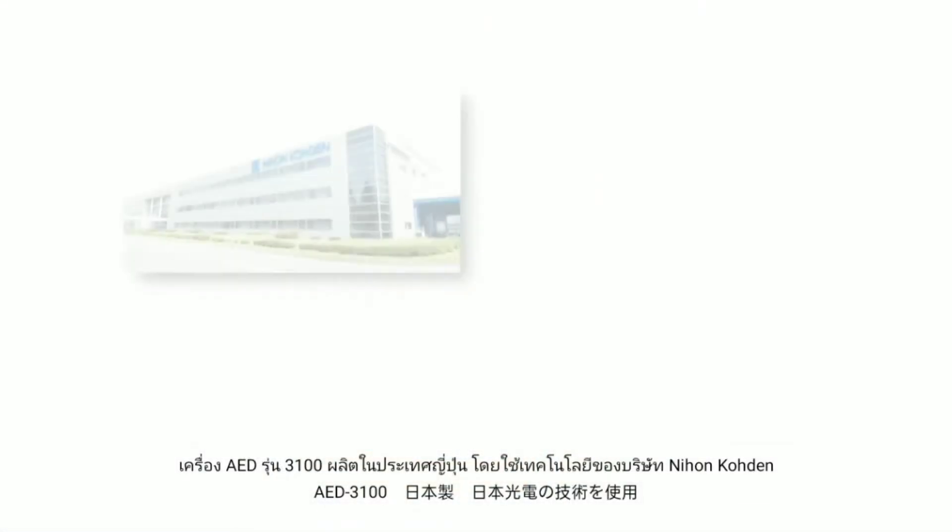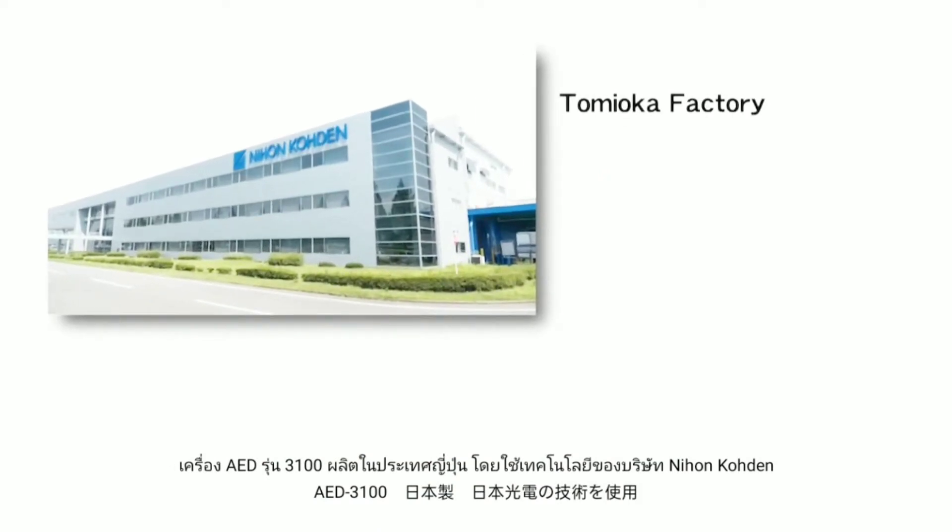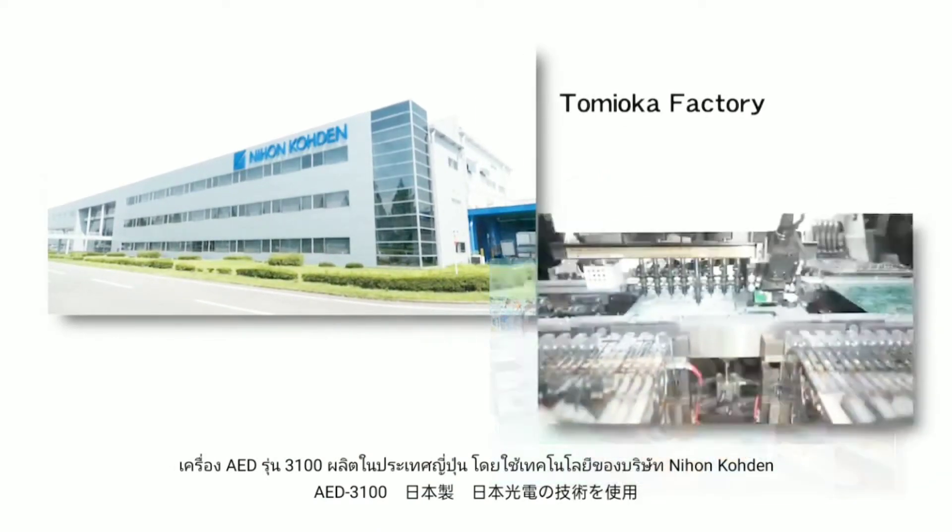AED-3100 is a Japanese-made AED using Nihon Kōden technology.